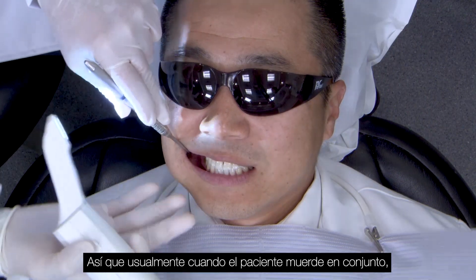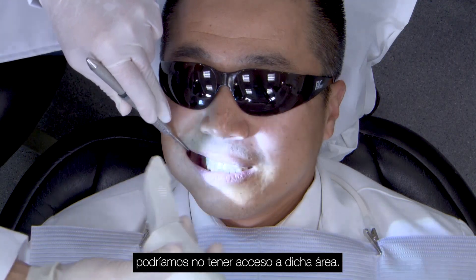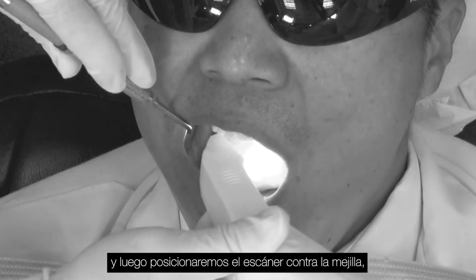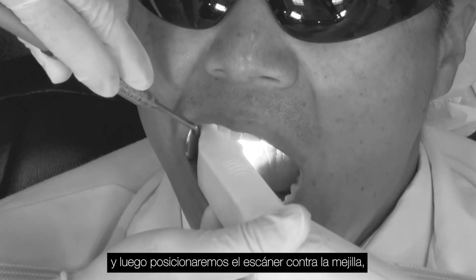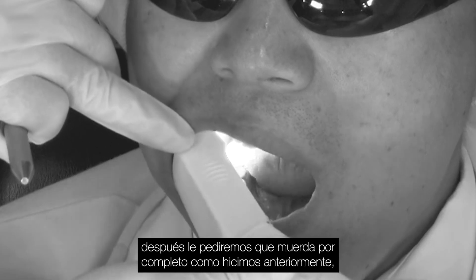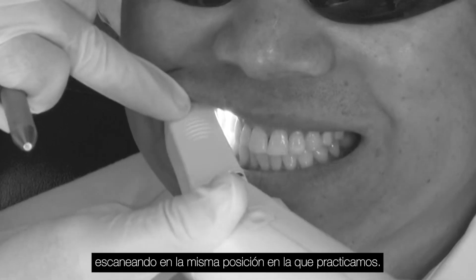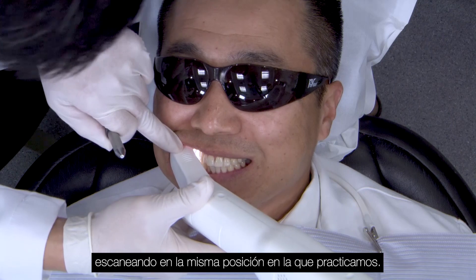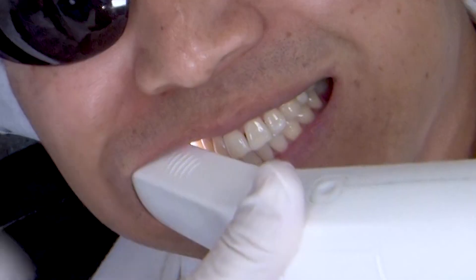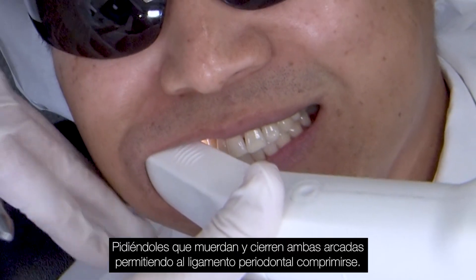Usually when the patient is biting together we may not have access to that area, so we'll first ask the patient to open good and open all the way — perfect — and then we position the scanner against the cheek. And now bite all the way down together like we did earlier, so we get them back into that same position that we practiced, and now bite down with pressure.